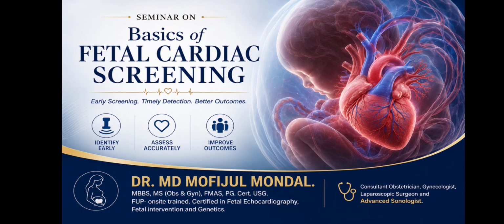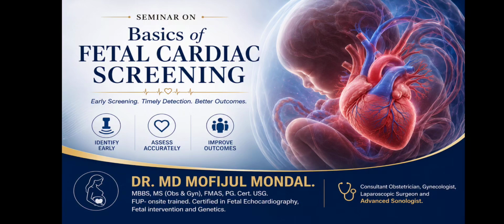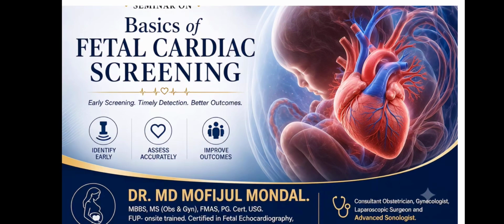The fetal heart is one of the most fascinating and challenging organs to evaluate during the anomaly scan. Despite occupying only a small portion of the fetal thorax, congenital heart disease remains one of the most common congenital anomalies encountered in clinical practice. Today, I will discuss the basics of fetal cardiac screening.